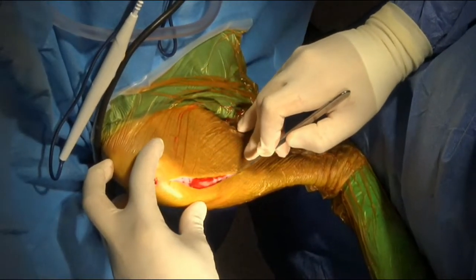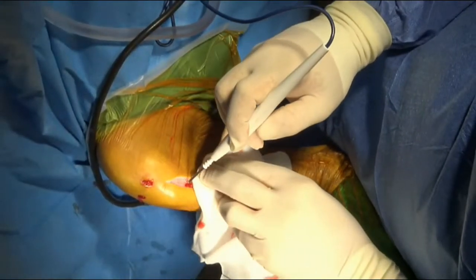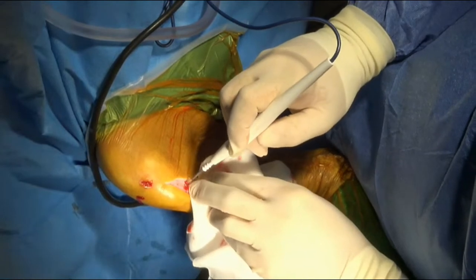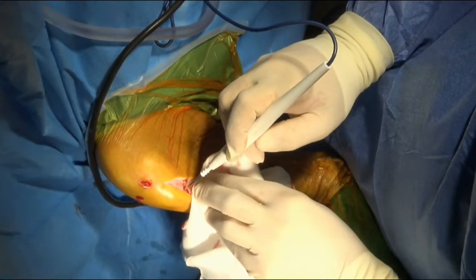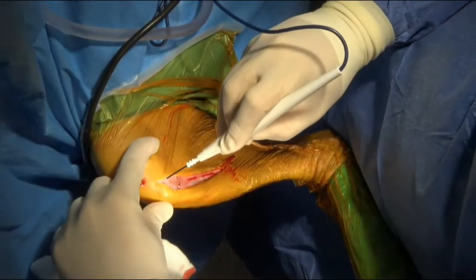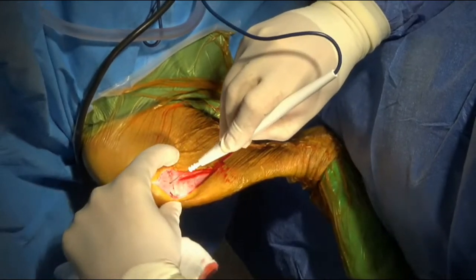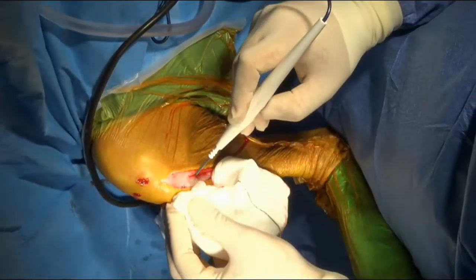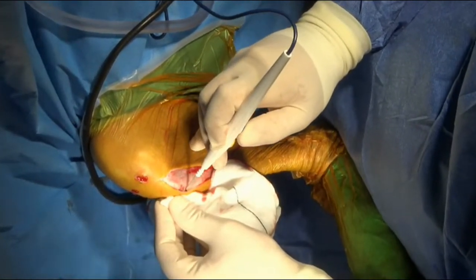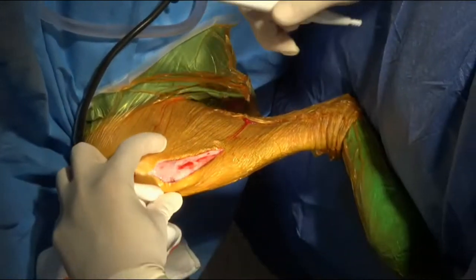So we've already done an arthroscope on this dog's knee. I haven't actually recorded or filmed the arthroscope. I don't have the technology in Mornington at the moment to be able to show you the scope as well as the surgery. So we have assessed the knee inside the joint. The cruciate ligament was an early partial tear, so we left that intact. The medial meniscus was intact, and so everything was looking in pretty good shape there. Not at all surprising because it is a pretty young dog.